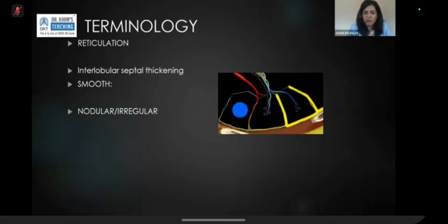The confounding factor comes in when it's the same patient cohort. So it's the older, more frail patients that typically present with idiopathic ILD, and it's the same age group or the same sort of patient that will present with a cardiac abnormality. So sometimes it can be a bit of both, and sometimes you can't really tell them apart. So that's the septal thickening bit.